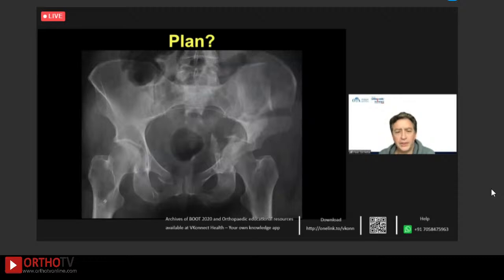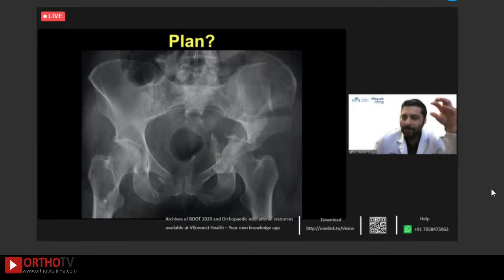So what do you guys think of that? Yeah, so obviously a highly comminuted complex both column with the segmental posterior column is so hard to deal with. If it's just a both column fracture that happens to have a wall component, I don't worry about that as much because it's not the same as a regular posterior wall, right? And you can try to actually capture it and get a screw in from intrapelvic to capture it.